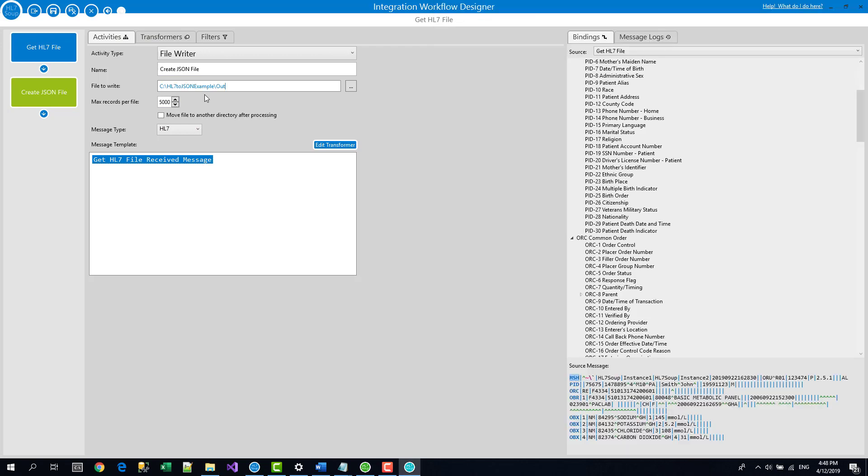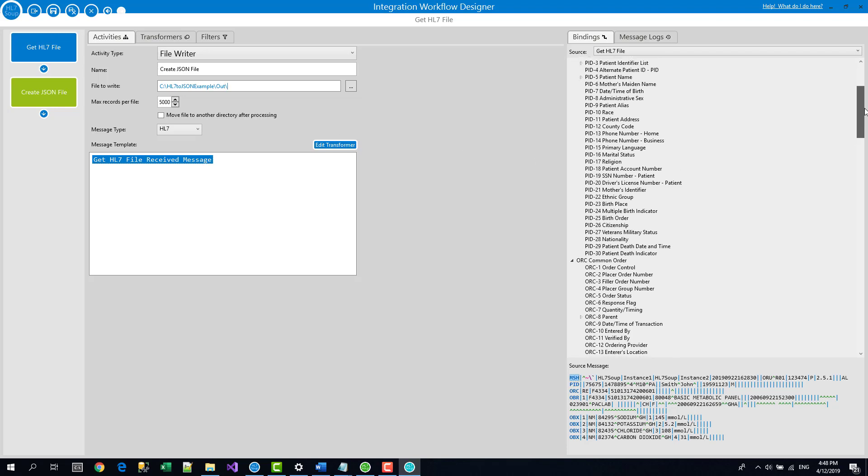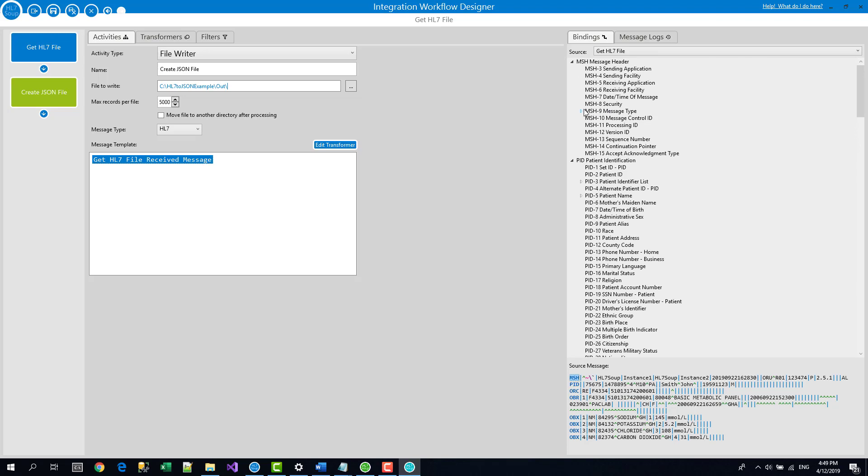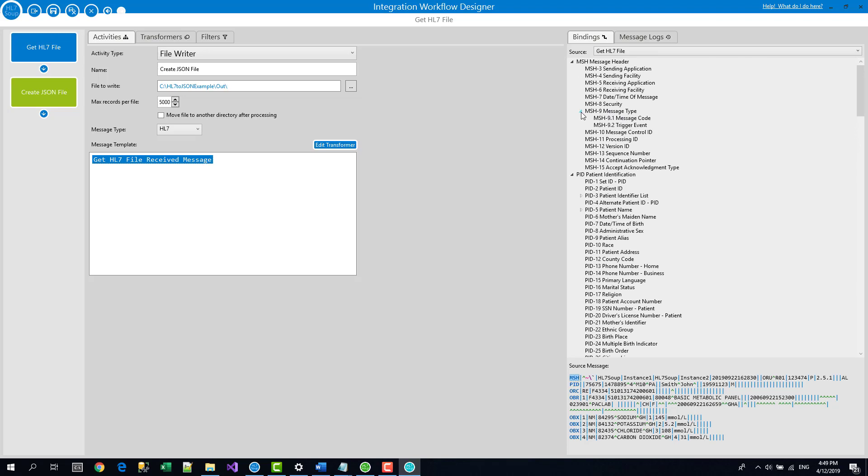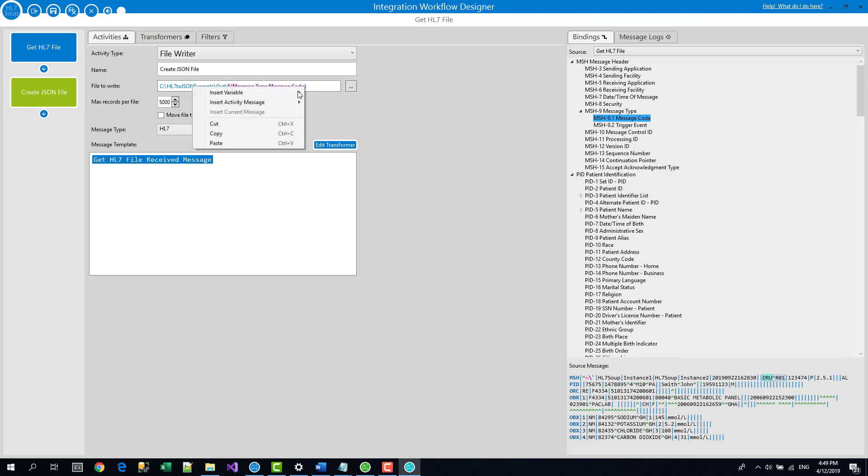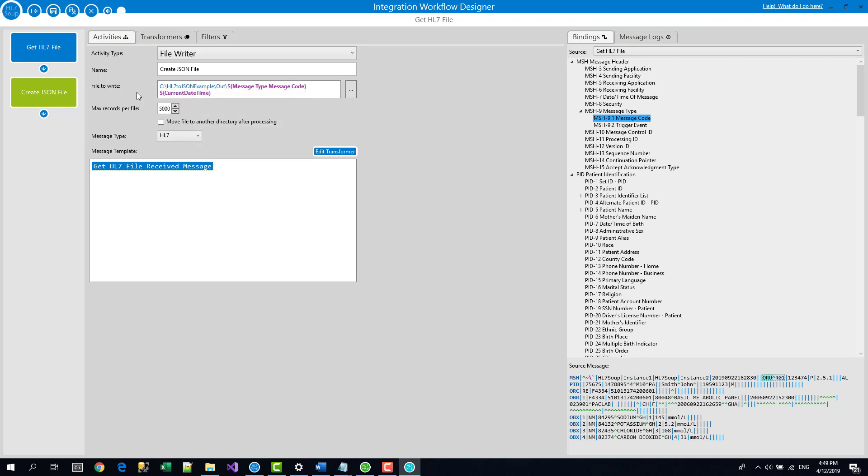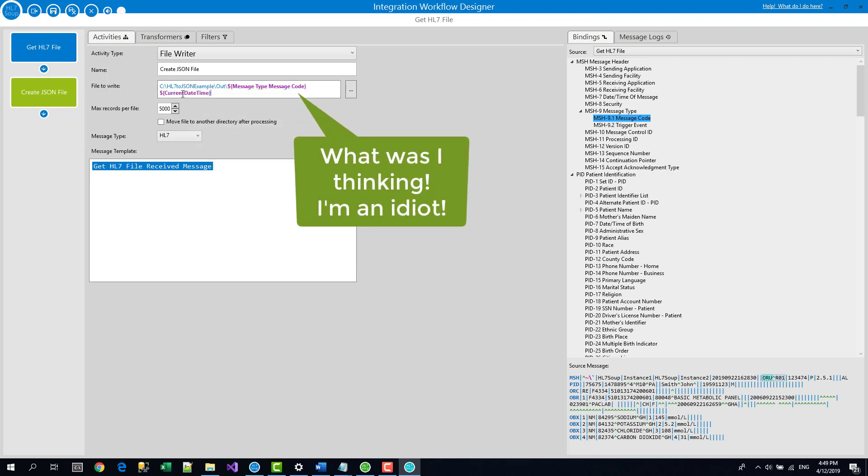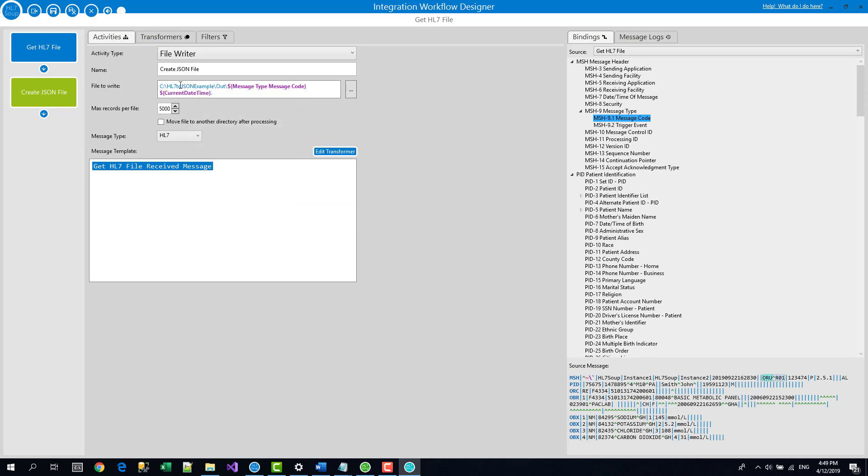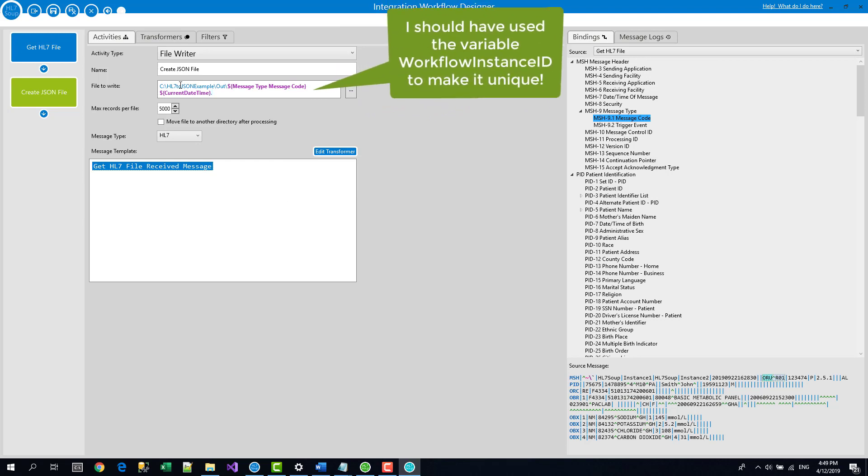I'm just going to paste it in to help me out and then I just need to get a file name and I'd kind of like to have that file name sort of self generate. So what I'm going to do is I'm going to use the message type that was passed into us. So that's the, you know, your HL7, this is the MSH 9.1. I'm just going to drag that message type into the file name and let it go there. And that's created what's called a variable that's going to be replaced at runtime with the actual message type that that message was.